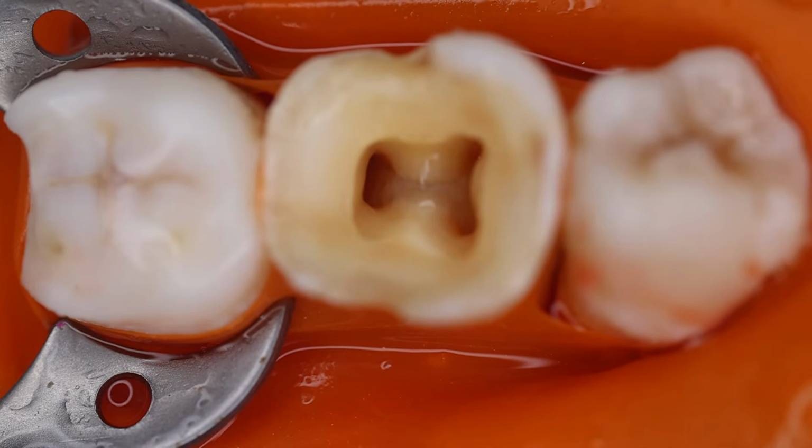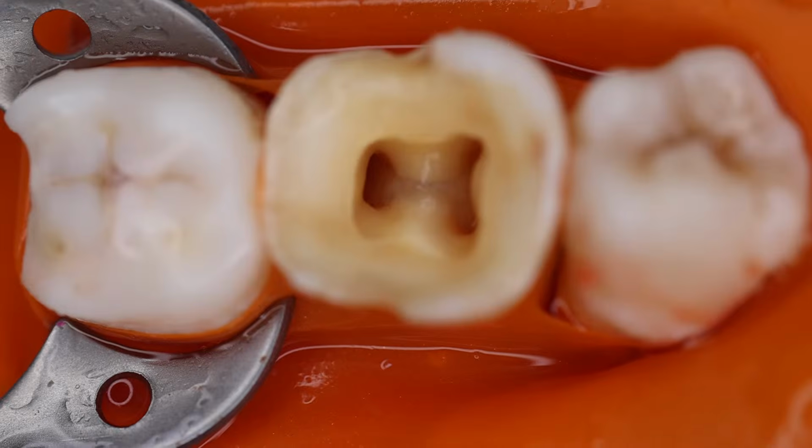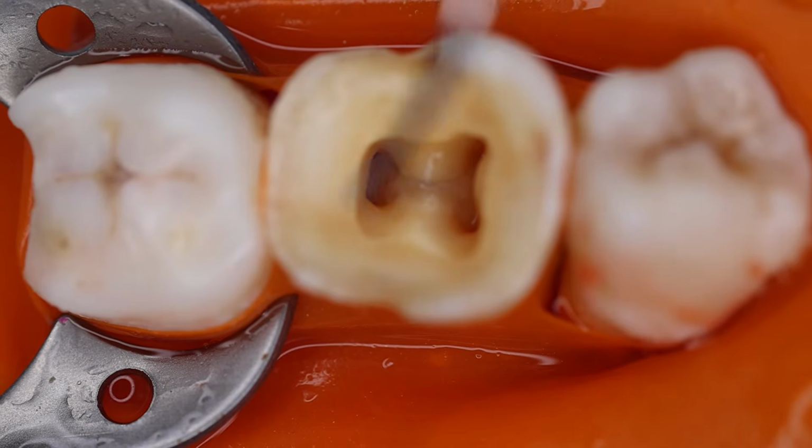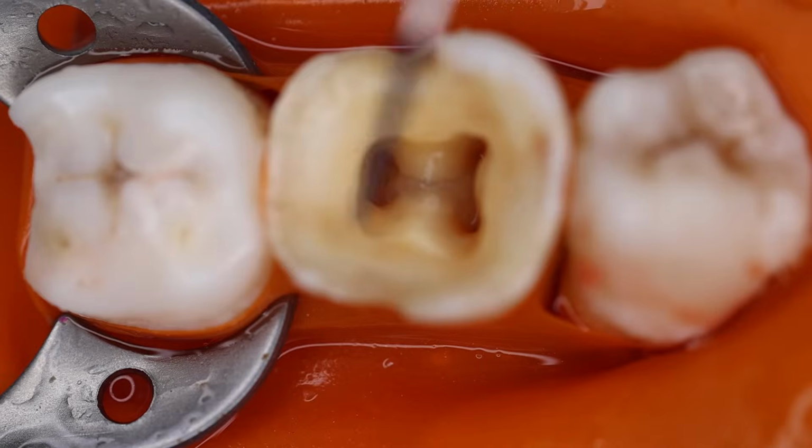So this is how you would flush out the sodium hypochlorite with the saline, and then this is the time you can proceed with working length determination. And this working length can be determined with the help of the electronic apex locator. So this would be covered in the next session that would be scheduled today.